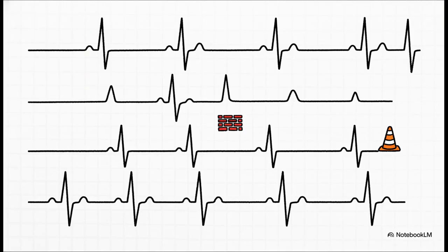Let's move to the next concept and see how this builds, because this is what happens clinically when that PR interval starts to stretch into various AV blocks. If the PR is consistently longer than 5 small boxes, basically 1 big box, you have a first-degree block.